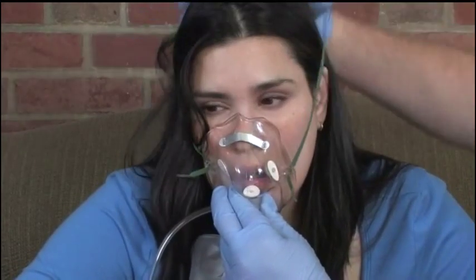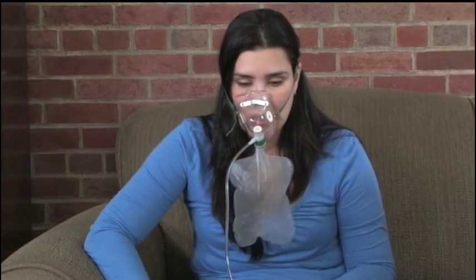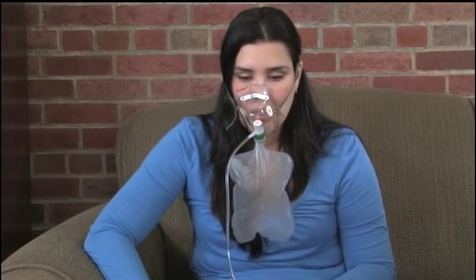Position the mask over the patient's nose and mouth. Slip the elastic strap over the patient's head so that it rests above the patient's ears, and tighten the strap as needed. Watch the volume in the reservoir bag when the patient inhales from the mask — the bag should be at least half full.